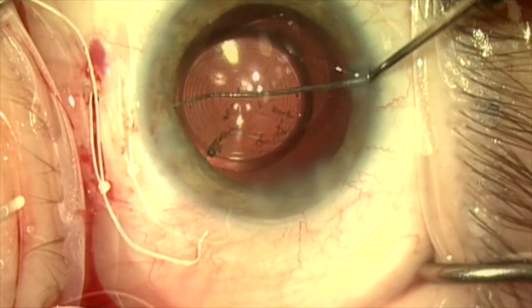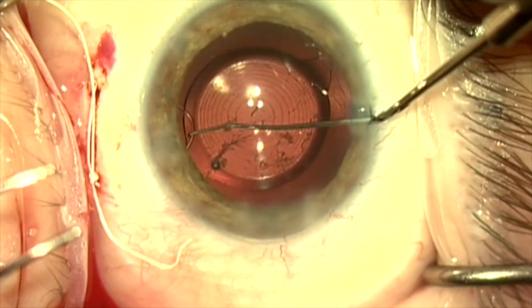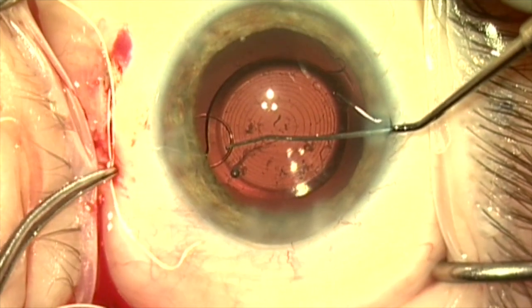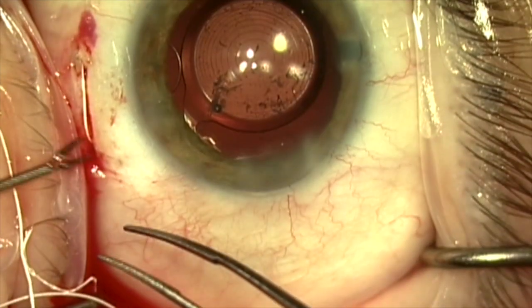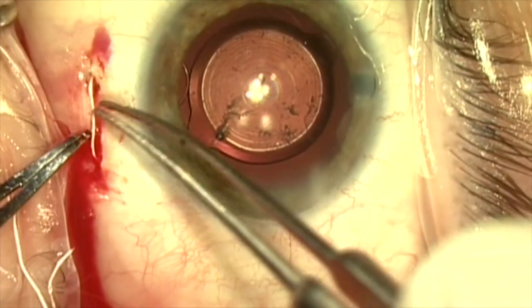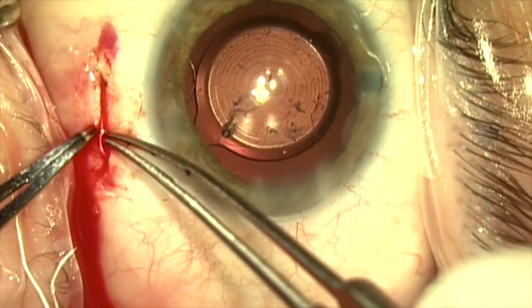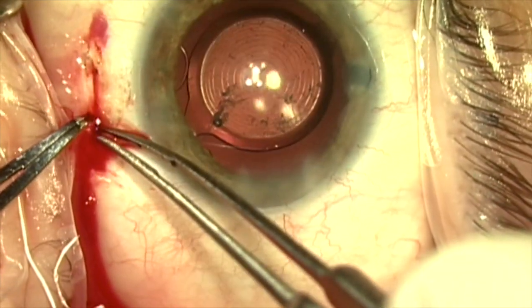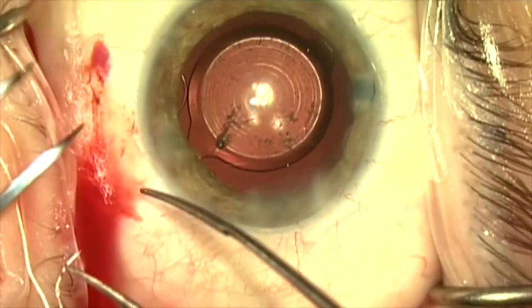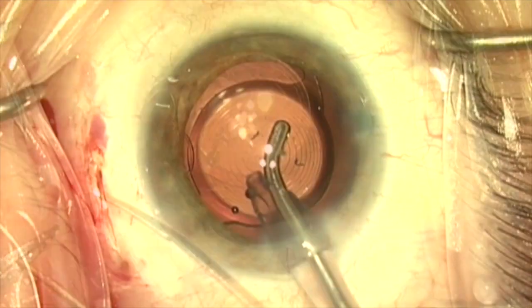You can see it's already being pulled over a little. So I'm going to reach in with a Sinskey hook and grab the capsule tension ring and give it a little tug to tighten the suture as I rotate the knot in. There's a little bit of slack, but that's fine because I'm going to tuck that under the scleral shelf I've created, which will prevent extrusion, keep it completely covered, and maintain the tension I want. You can see the scleral shelf has now covered that suture.